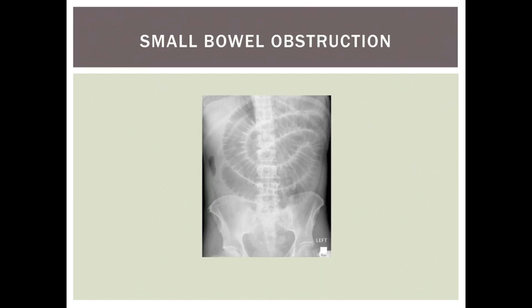This x-ray shows small bowel obstruction. The valvulae extend the whole way across the bowel, confirming that this is dilated small bowel, and there is no large bowel visible, which confirms this is small bowel obstruction. Large bowel obstruction can also give dilated small bowel in the presence of an incompetent ileocaecal valve that allows reflux of air backwards from the caecum into the small bowel. Large bowel obstruction without small bowel dilatation is at higher risk of perforation, as it suggests a competent ileocaecal valve and therefore a closed loop with constantly increasing pressure.